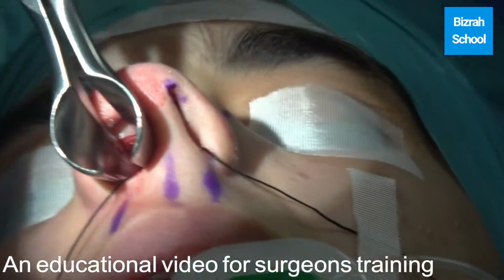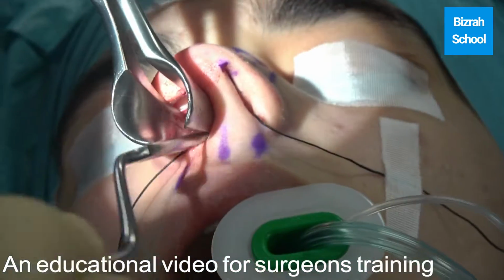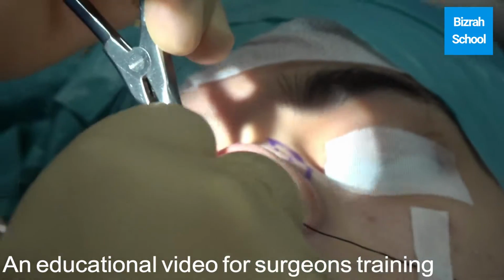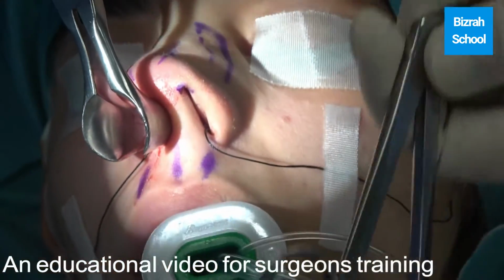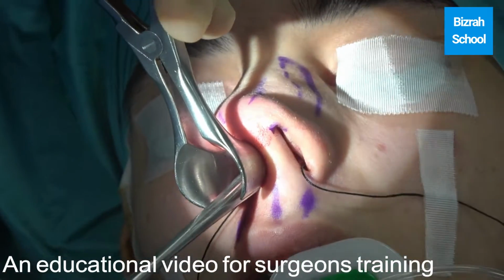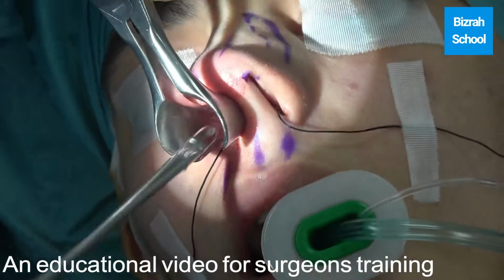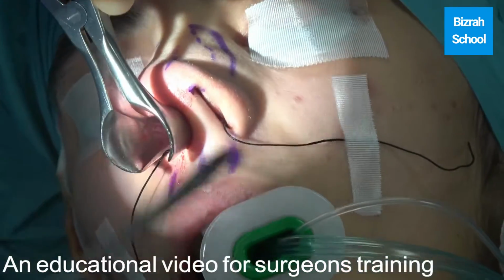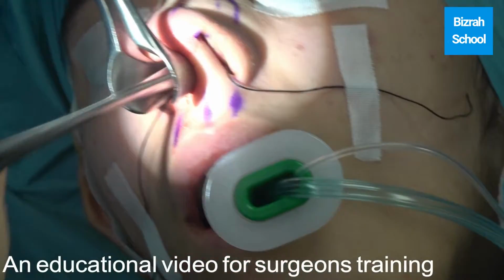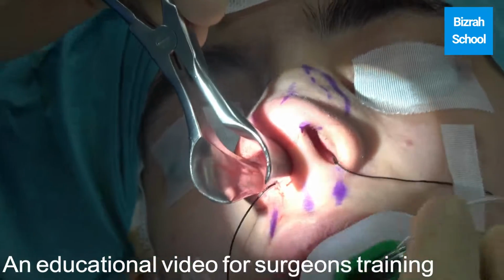Bayonet jug straight away. With the bayonet jug we get the piece of cartilage out, because we will need cartilage for a tip graft, for a columellar strut, and for a spreader graft on the left side. So we need a good piece of cartilage with preservation of the dorsal L-strut. Okay, nice.